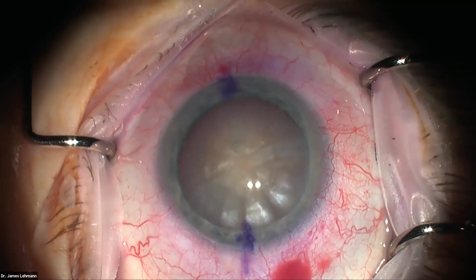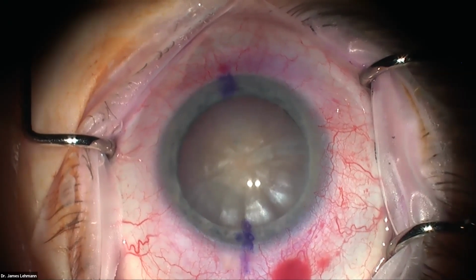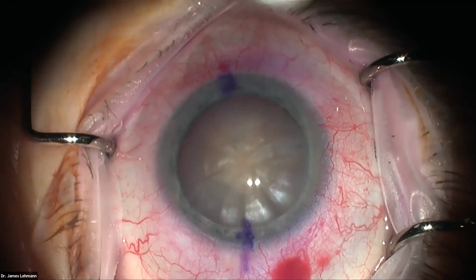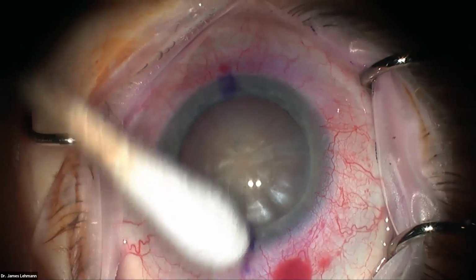All right, everybody, thanks again. So we're looking at the patient here and you can see it's a mature cataract. I'm going to get started. You can see again the little hemorrhages from the femto. We had to mark her eye.